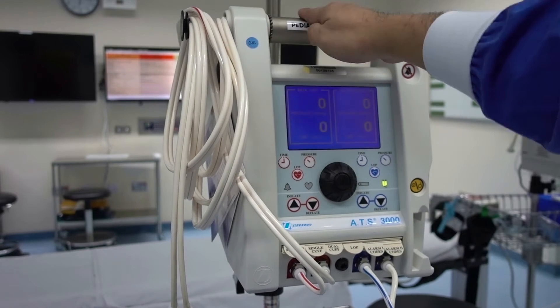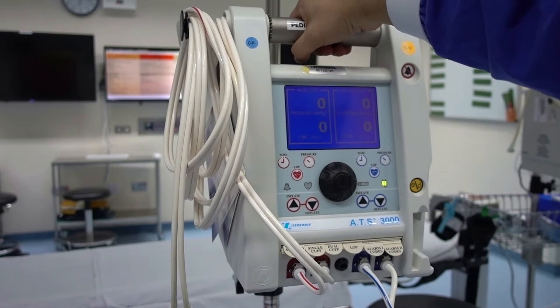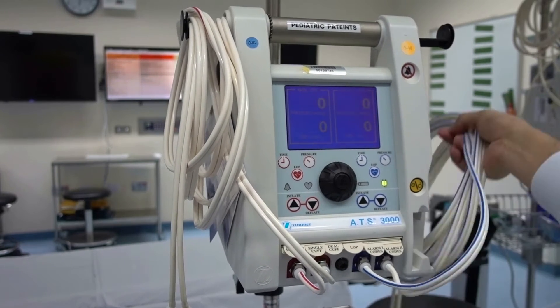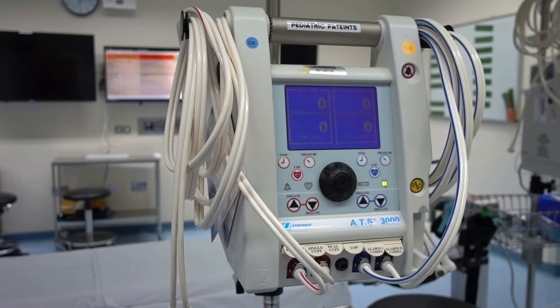Now let's turn the unit to the front. On top is your carrying handle for easy transport. It includes pull-out hose hangers on both sides for storage.